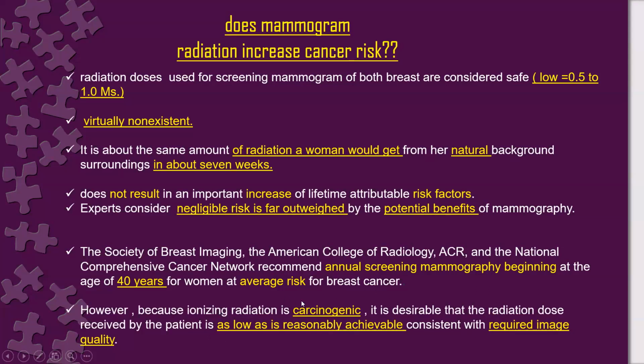However, because ionizing radiation is carcinogenic, it is desirable that the radiation dose received by the patient is as low as reasonably achievable, consistent with required image quality.